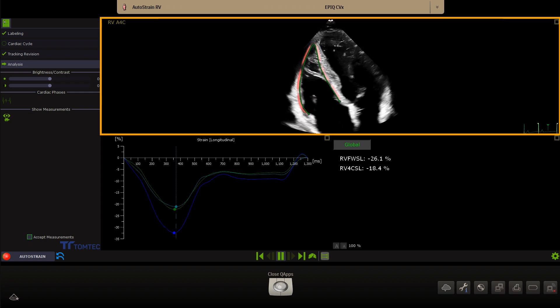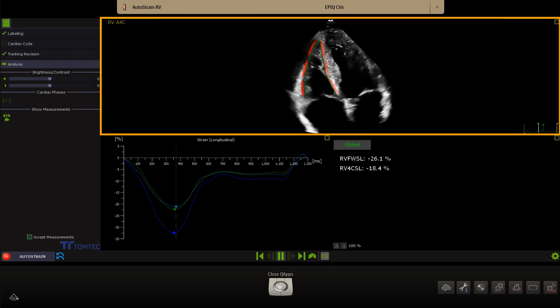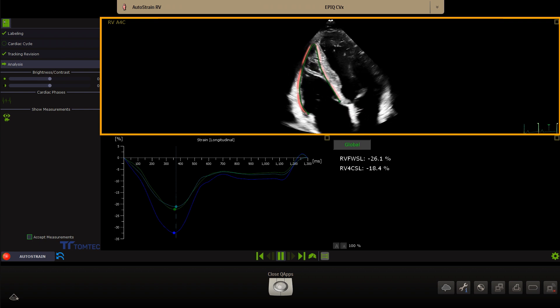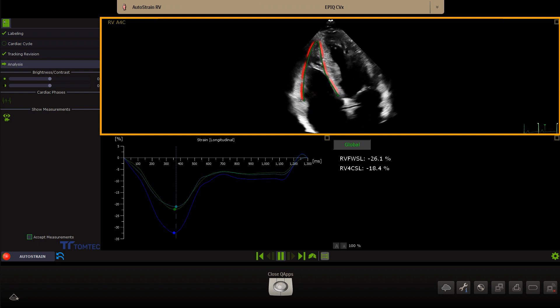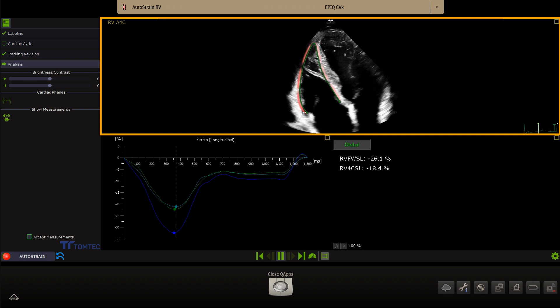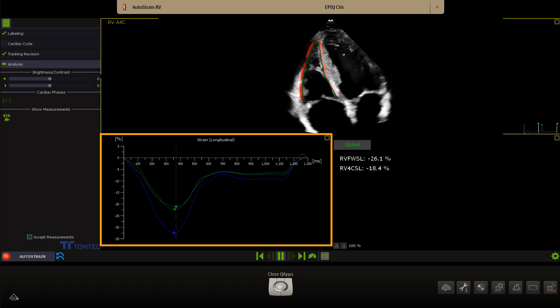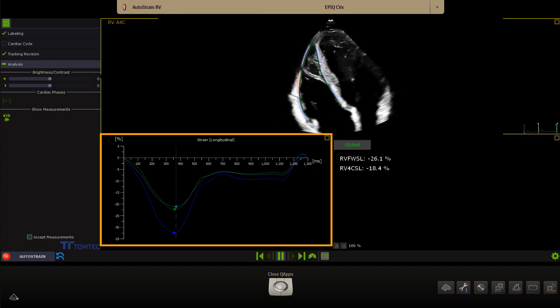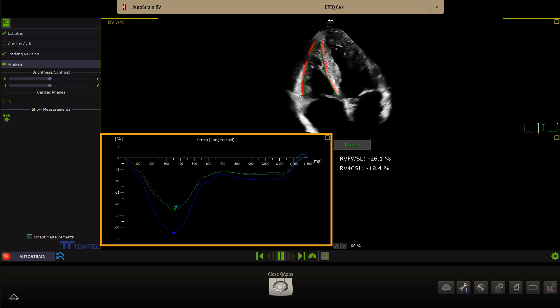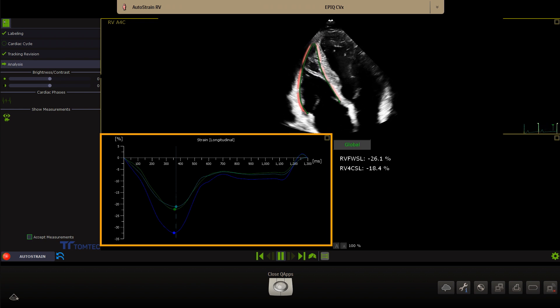On top you see the RV-focused apical 4-chamber view. The contour position and tracking can be reviewed on the dynamic 2D loop.